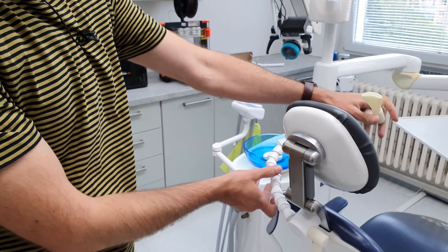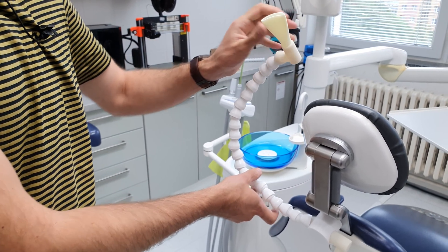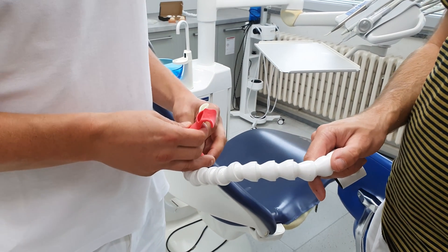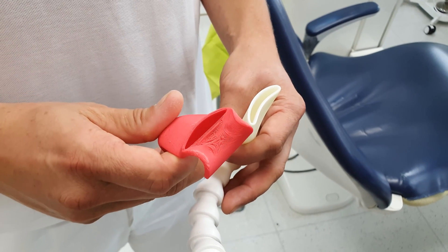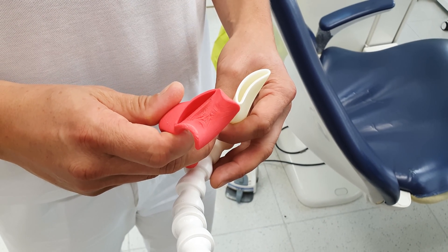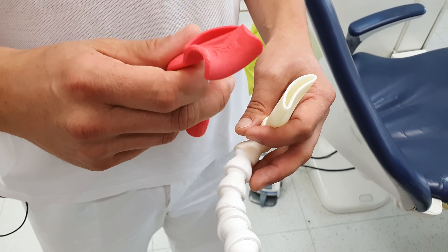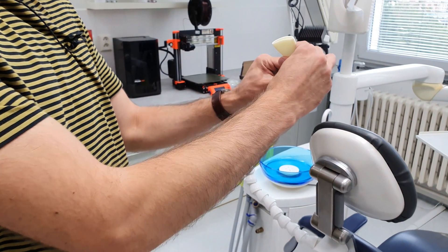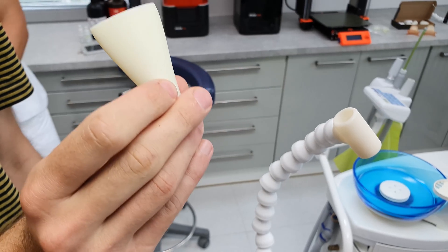Soon we switched from FDM 3D printing to SLA. FDM is great, it's cheap and reasonably quick, however from a hygiene point of view it's not suitable. Objects printed using the FDM method cannot be sterilized in our autoclave, because they can't withstand high temperatures. SLA, on the other hand, allows us to produce objects using biocompatible resins, which are temperature resistant and they can be sterilized in the autoclave.